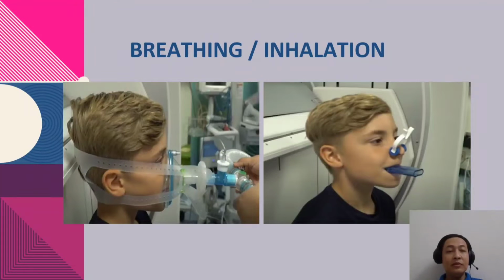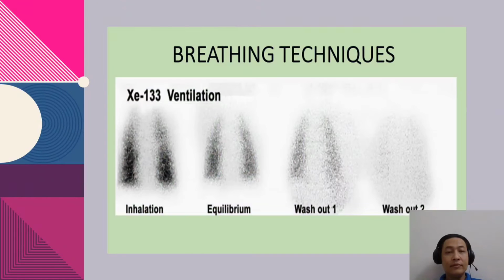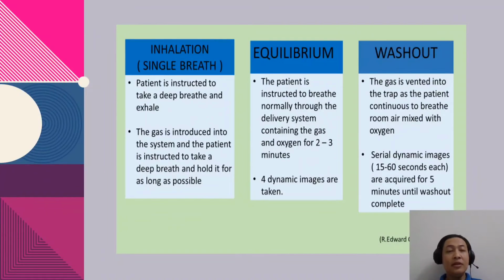This is an example where the patient wears a mouthpiece and nose clip. Each image looks different according to the level of accumulation until washout. Inhalation, single breath: the patient is instructed to take a deep breath and exhale. The gas is introduced into the system and the patient is instructed to take a deep breath and hold it for as long as possible.